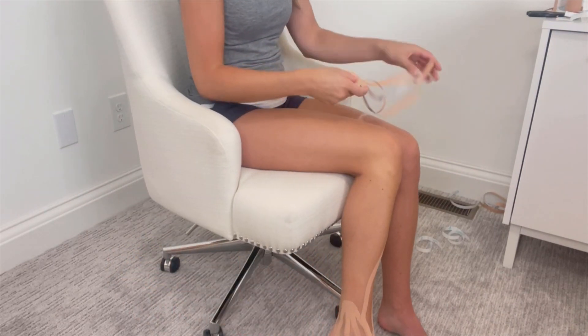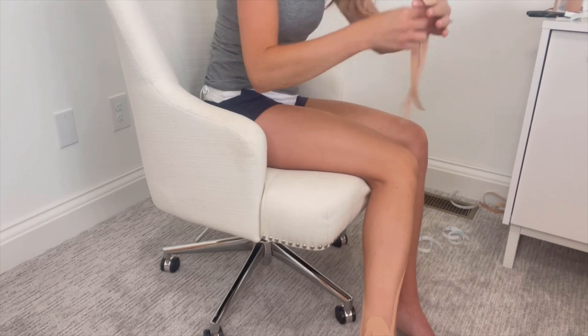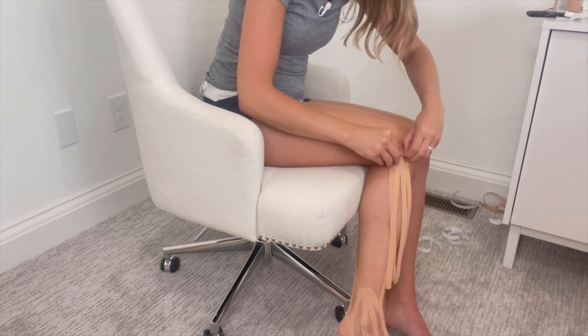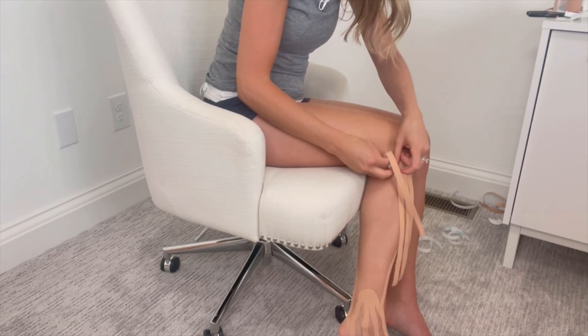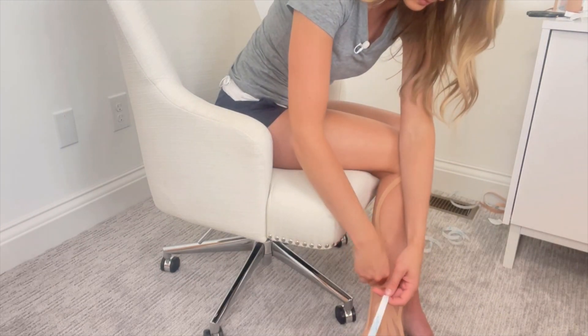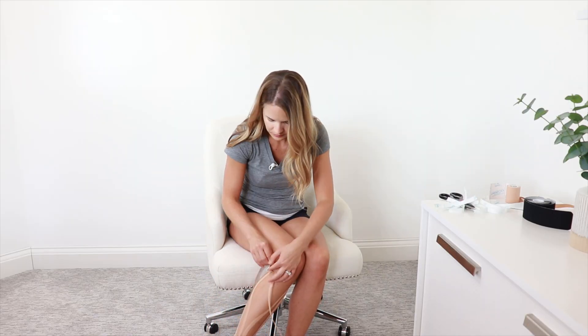Then we'll do the same thing on the back side — tear off the backing, start on the outside, and go far around the back to cover all sides of the lower leg. And that's how I do the foot and the lower leg.